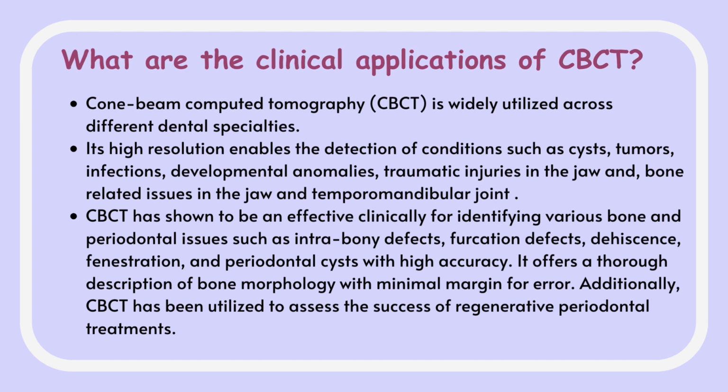CBCT has been shown to be clinically effective for identifying various bone and periodontal issues such as intrabony defects, furcation defects, dehiscences, fenestrations, and periodontal cysts with high accuracy. It offers a thorough description of bone morphology with minimal margin for error. Additionally, CBCT has been utilized to assess the success of regenerative periodontal treatments.